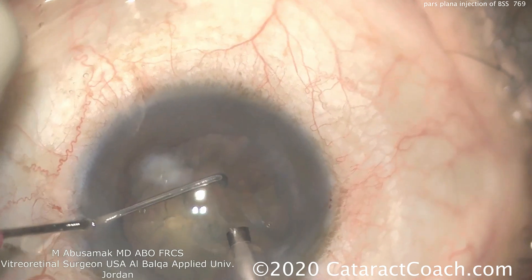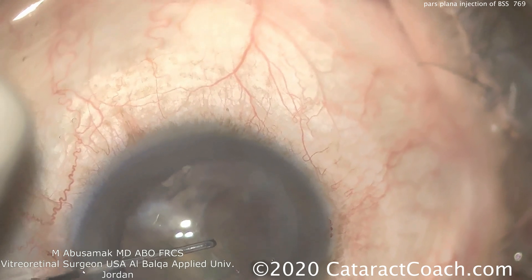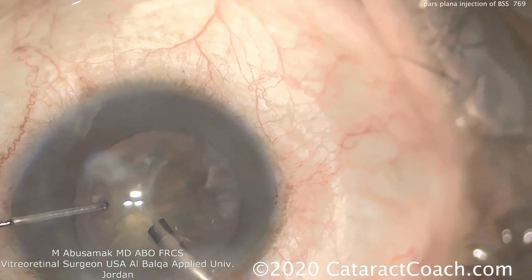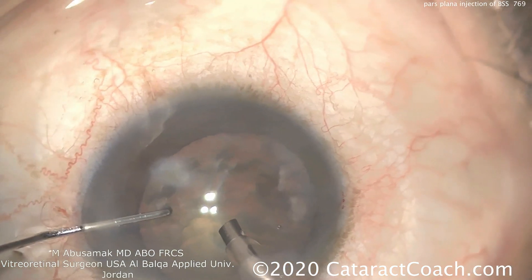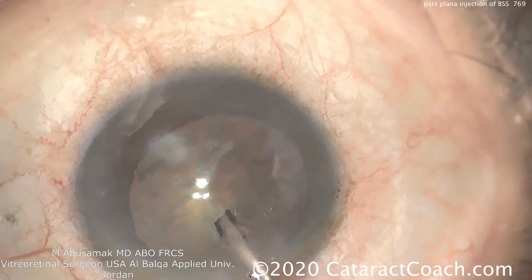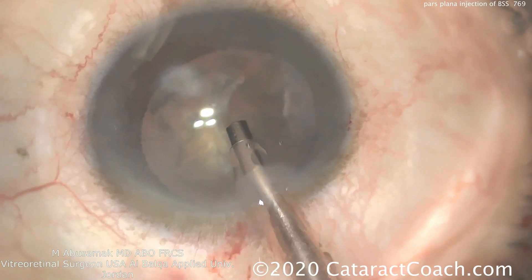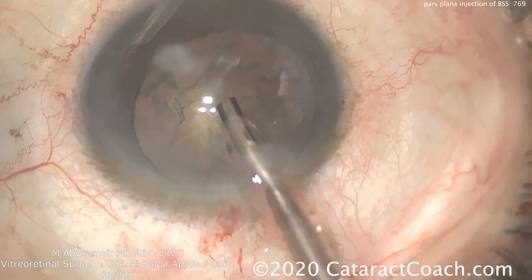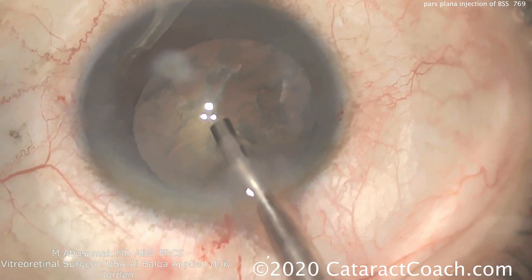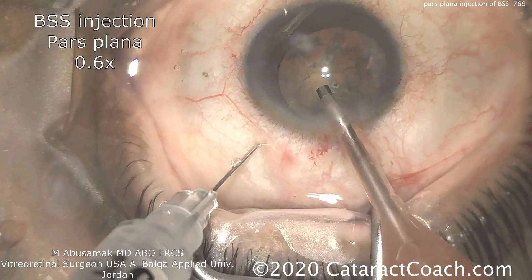The challenge that the surgeon has is a very, very deep anterior chamber. We can see this frequently in patients who are very myopic. You can see it in patients who've had a prior pars plana vitrectomy. There's a tendency for the whole lens-iris diaphragm to be pulled posteriorly. There's no reverse pupillary block at this point — this is just deepening due to anatomic issues.